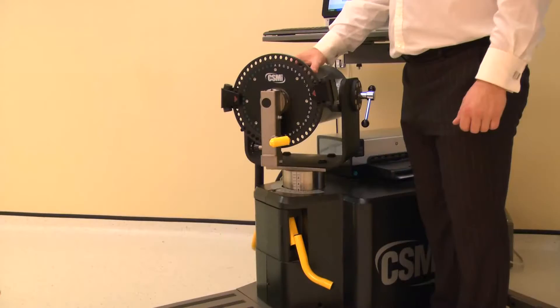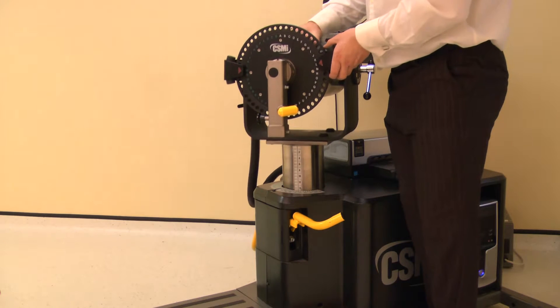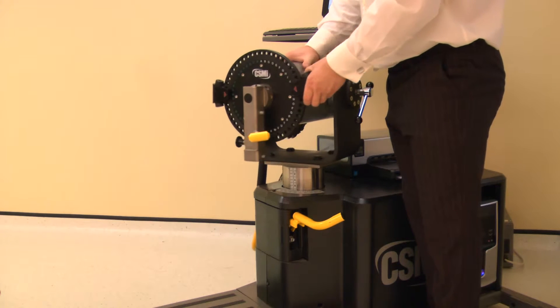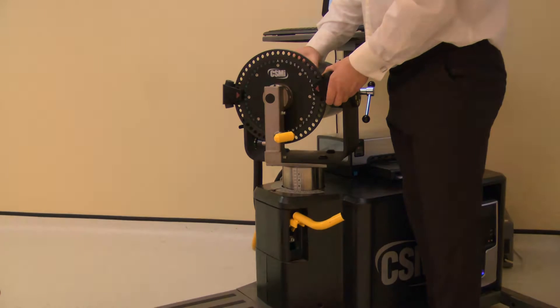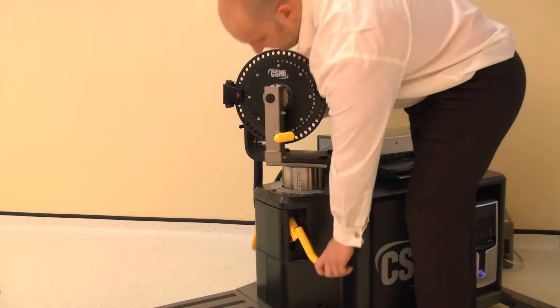The dynamometer height and rotation are adjusted together. Lift the locking handle to release. Rotate the dynamometer to 35 degrees on the black scale, whilst also adjusting the height to position 27. Ensure both locking handles are pushed down to secure.